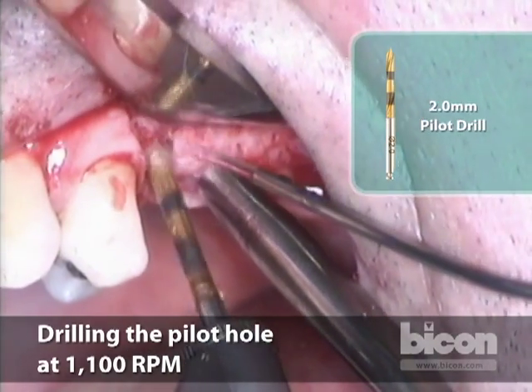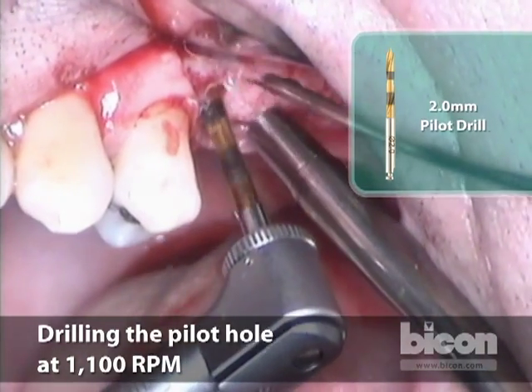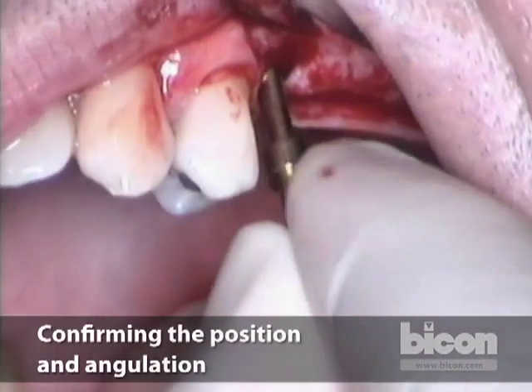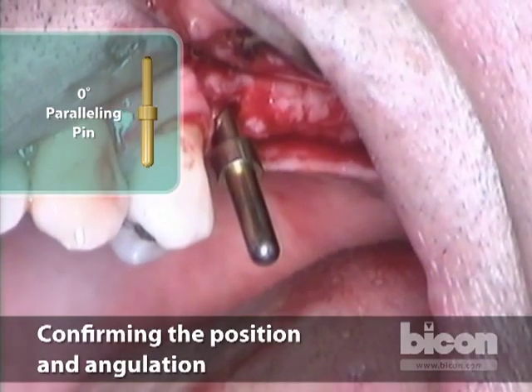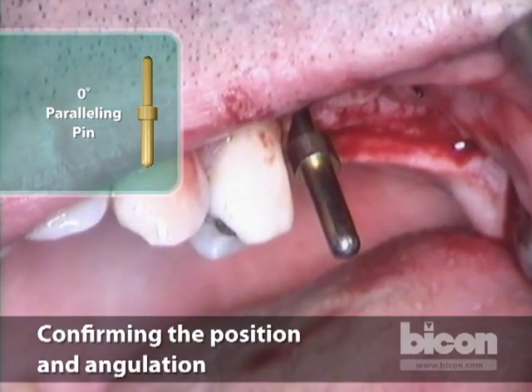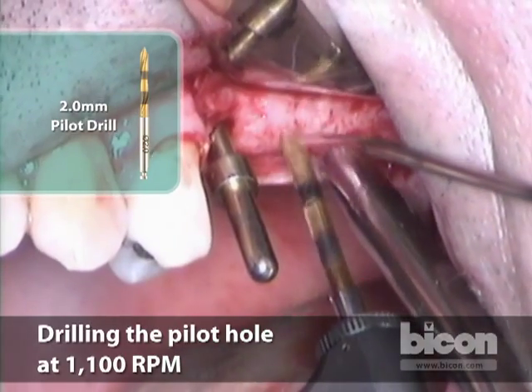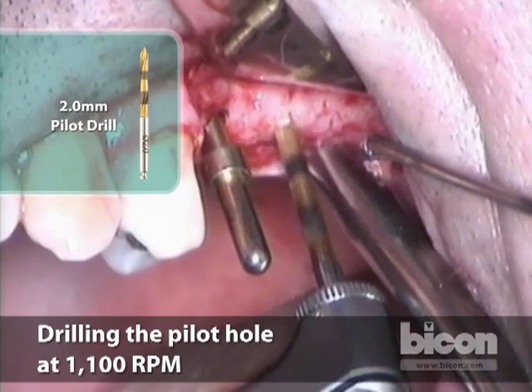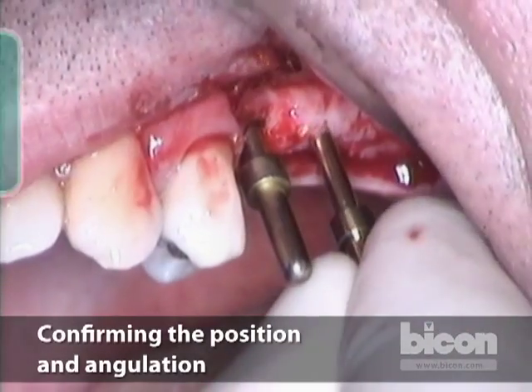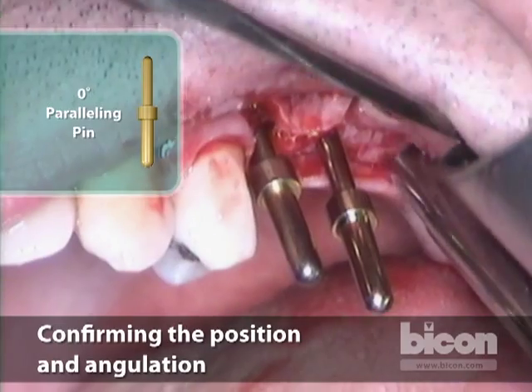We'll tow it in a little bit and go in roughly about six to seven millimeters. This is now a more reasonable position. We will use that as a guide for the next pilot hole, which will be significantly shallower since we will be getting very close to the sinus. I want to drill just about three millimeters and stop, because the floor of the sinus was at a slope and the edge of this initial pilot hole might already be encountering it.